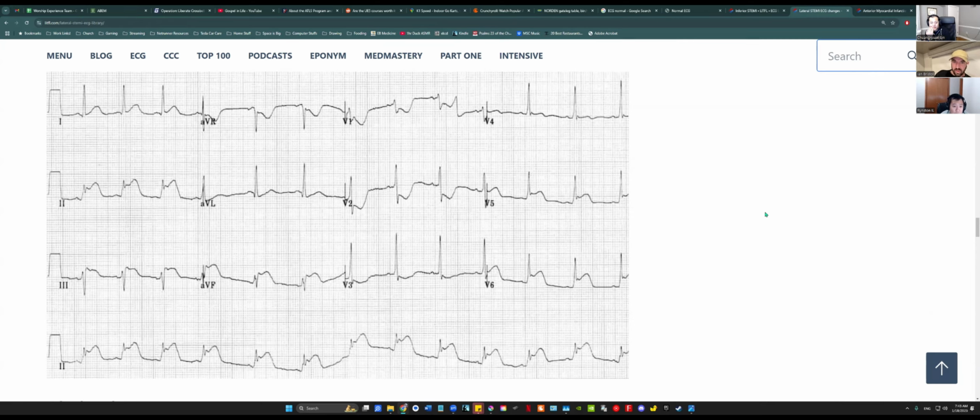And even aVR. Inferior lateral, yeah, I'd agree with that. Not that you're asking, but inferior lateral is a common combination, right? So let's look at this zone by zone. Let's look at the left lateral.